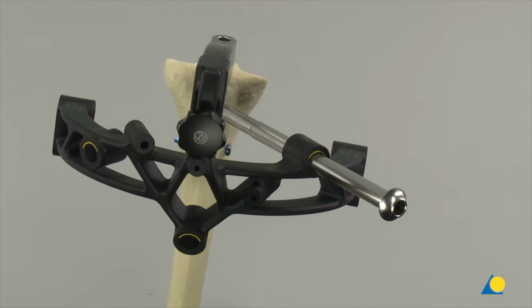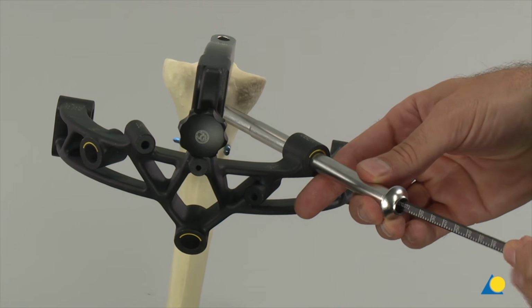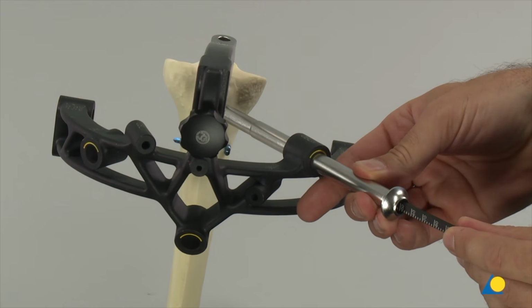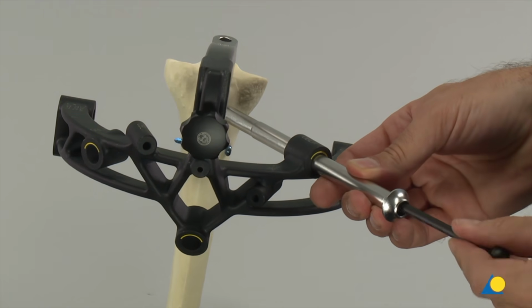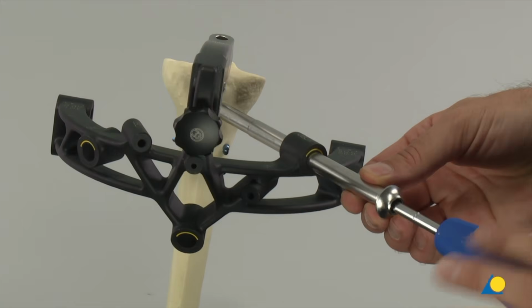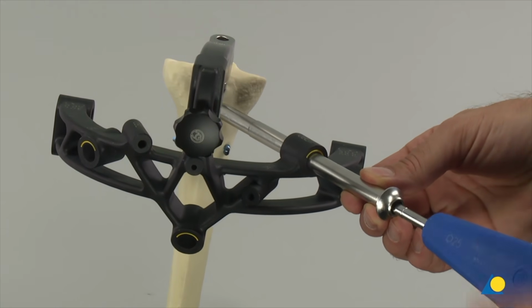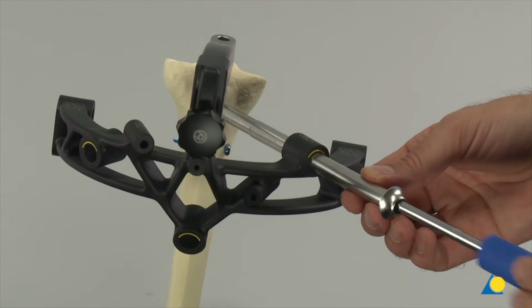While ensuring that the protection sleeve is pressed firmly to the bone, the measuring device is slid through it, making sure that the hook grasps the far cortex. The length of the screw is determined by reading the measurement at the back end of the protection sleeve. In this case, 50 mm is measured. The 5.0 cancellous bone locking screw is inserted through the protection sleeve and threaded into the hole with the screwdriver star drive T25, taking care not to over-tighten. Once the screw length has been verified, the screwdriver and protection sleeve are removed.